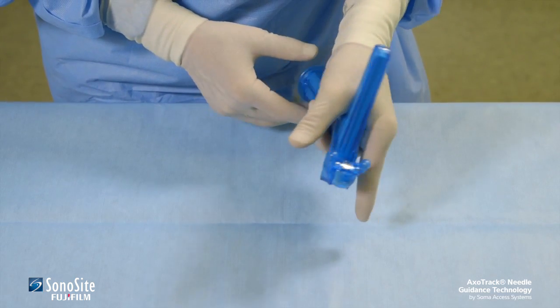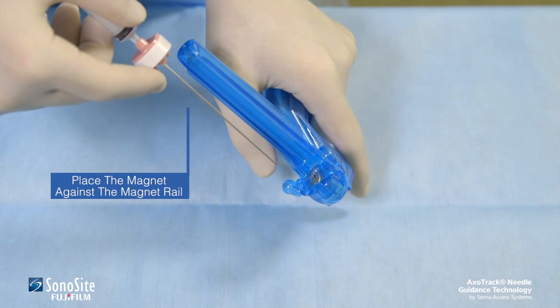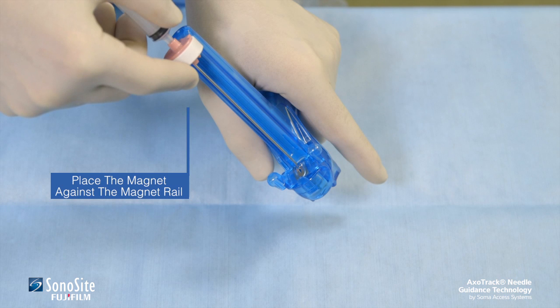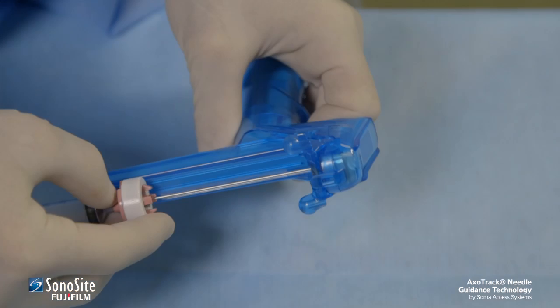If needed, adjust the grip to make sure the thumb can reach the needle clamp to secure the needle when desired. Insert the needle by placing the magnet against the magnet rail to stabilize the needle assembly. Align the needle tip with the needle guide orifice and advance the needle into the guide.